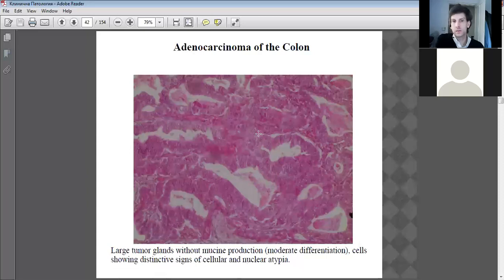And that's totally going to disaffect the function of mucus, mucin production and majorly disrupt the absorption of water and salts. Okay, eventually all this tissue is going to die and become necrotic as the carcinoma progresses in its pathology.